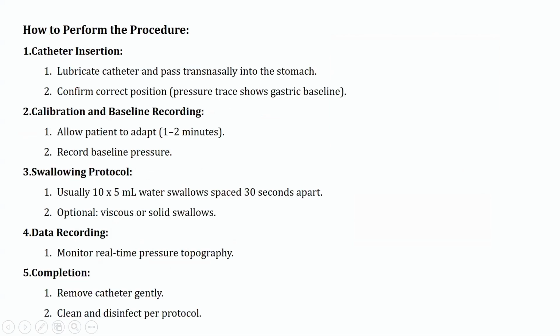And then once we want to insert, we can use lubricant to make it easier on the nose. There are some doctors who use anesthesia spray, or even gel. We can use it, but we should be very careful about this one.